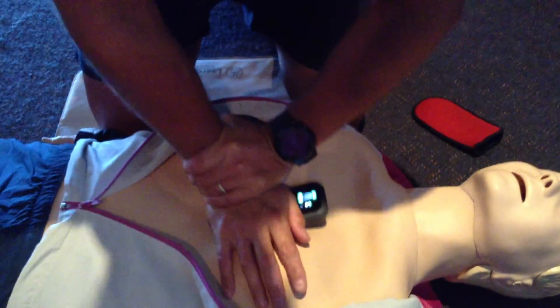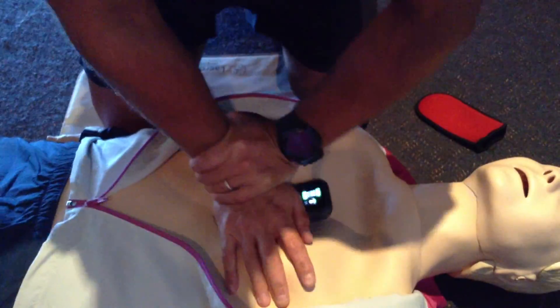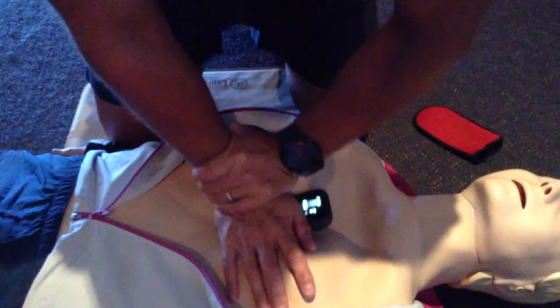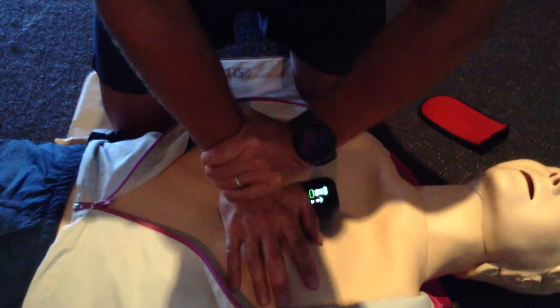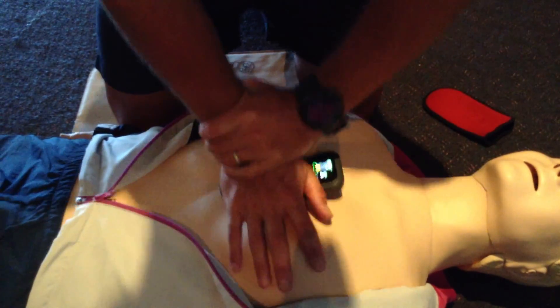As you can see, it measures in live view my rate, adequate depth, and adequate release. If I incorporate some errors into this demonstration, such as not achieving an adequate depth, very quickly you'll see that an arrow is pointing downwards, telling me to go deeper.